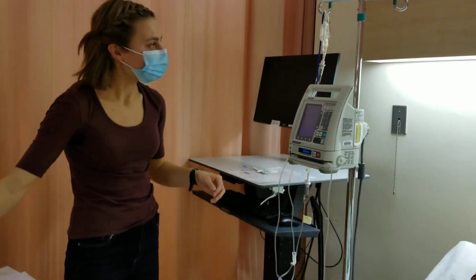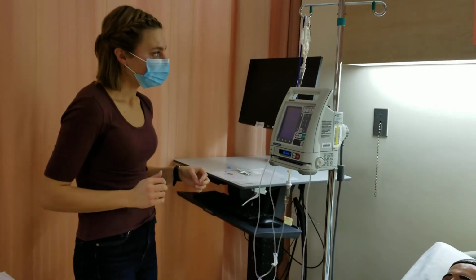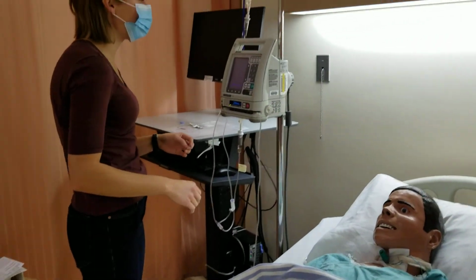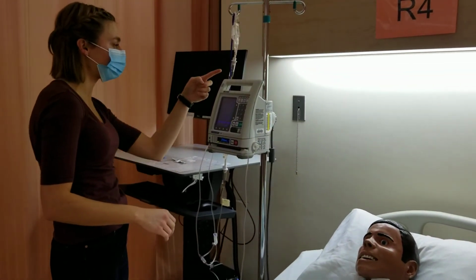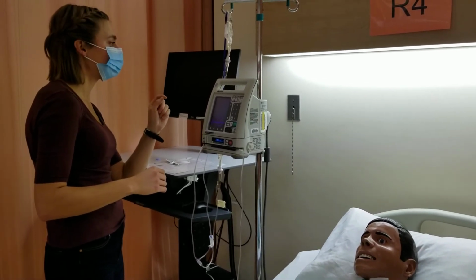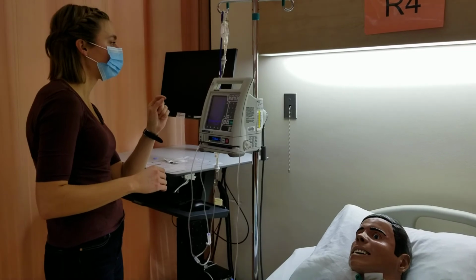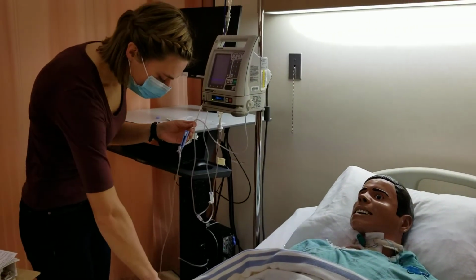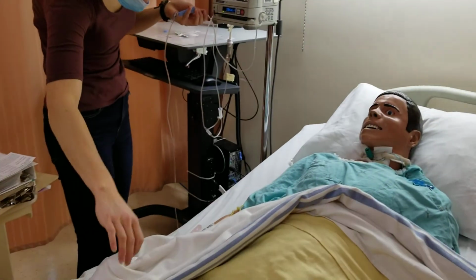I hit start, so I'm doing an exit safety check after I make sure that there's a few drops coming on here. So can I count 3 drops? 1, 2, 3. Good. And this is all open here. And it's infusing.